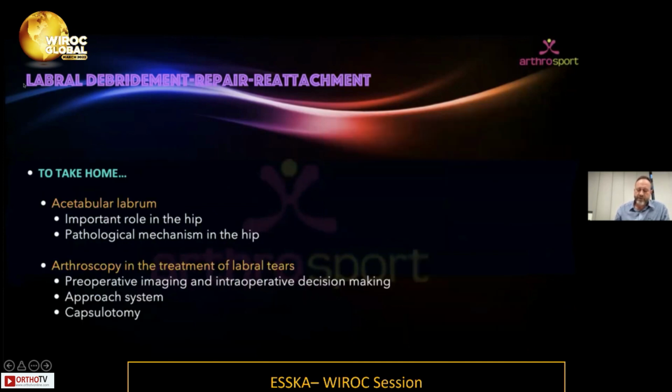After the placement of the anchor, the suture configuration should be selected. If we compare loop versus pierce suture technique for labral repair, the results are statistically and clinically similar, and there is no significant difference in revision or failure rates.